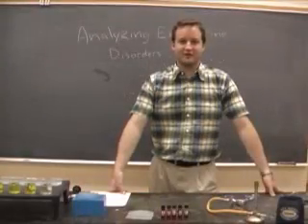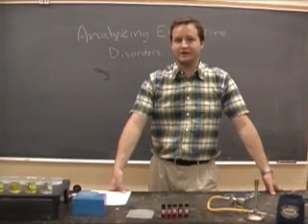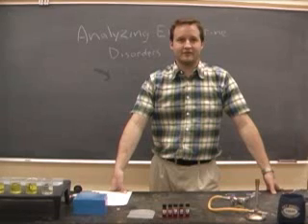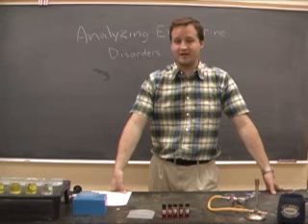Okay, welcome to analyzing endocrine disorders. Here's the situation. We have 5 patients. I have collected blood samples and urine samples from all 5 patients. We're going to carry out a series of tests on the samples, and based on the data, you are going to decide what condition each of these patients has.